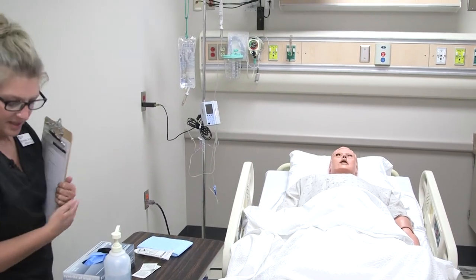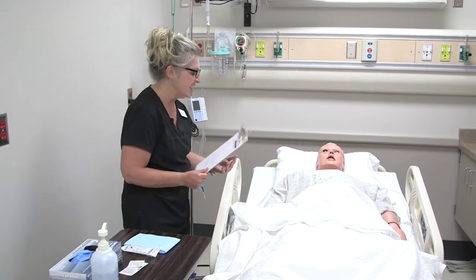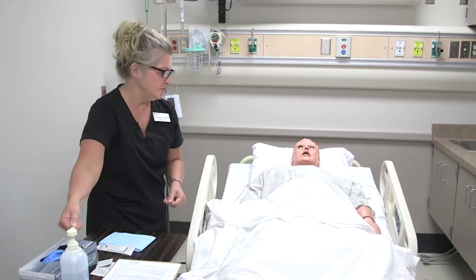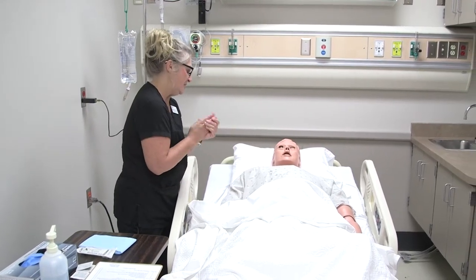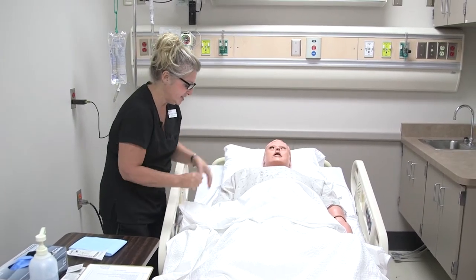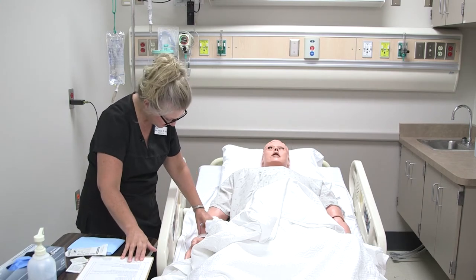Hello. Hi, Tim. My name is Mary. I'm a student nurse from the CVTC Technical College, and I am here to take care of you today. Would you prefer me to call you Tim or another name? Tim is fine. I'm just going to check your ID band here first, and if you could please give me your full name and date of birth.